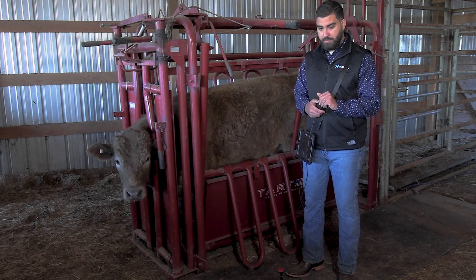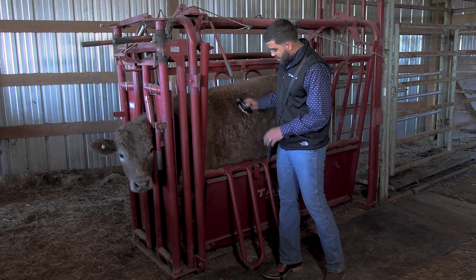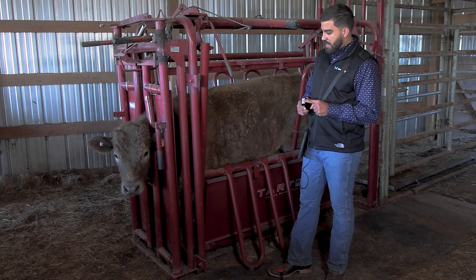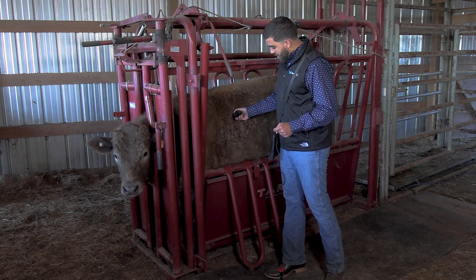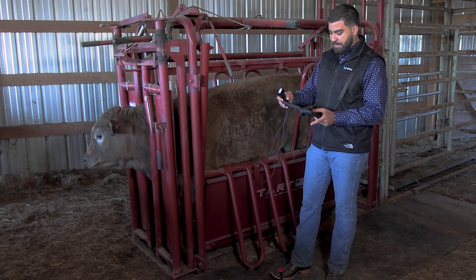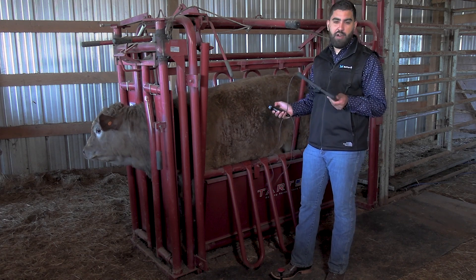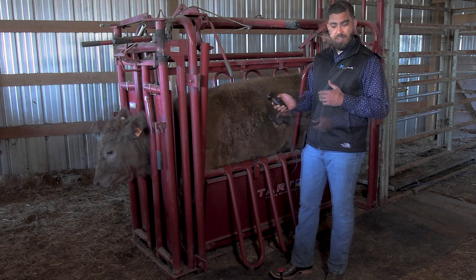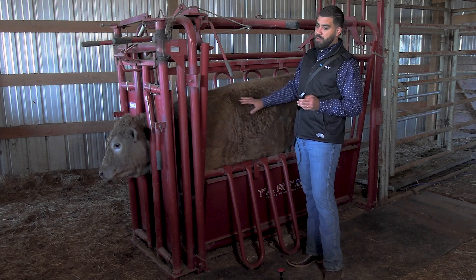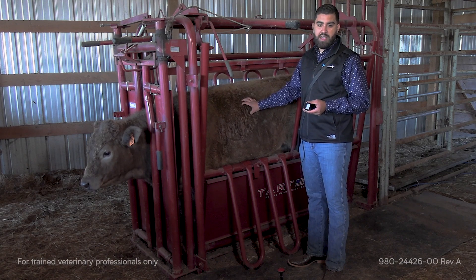With the IQ Plus VAT, we're able to look at the lungs with no problem. The probe's footprint is great for fitting right in between the ribs, even with both large and small animals. The ability to use an iPad or iPhone is also convenient — I prefer the iPad because I like a bigger image, but I've also scanned with a cell phone with no problem. If you have any questions, you can reach out to our team and we can help you with how to perform and evaluate the lung ultrasound.